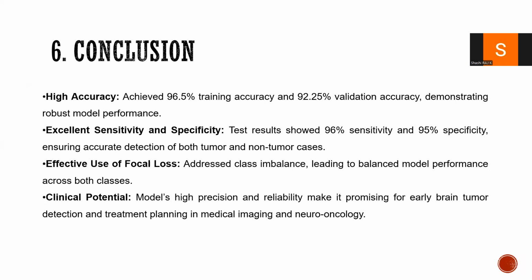For the fields of neuro-oncology and medical imaging, the model convergence during training is highlighted by the loss curve pattern shown in the previous figure 4, which is the visual depiction of the loss curves. This convergence indicates that the model weights and parameters have been refined iteratively, leading to decreasing losses and demonstrating the model's ability to extract discriminative features from MRI images.